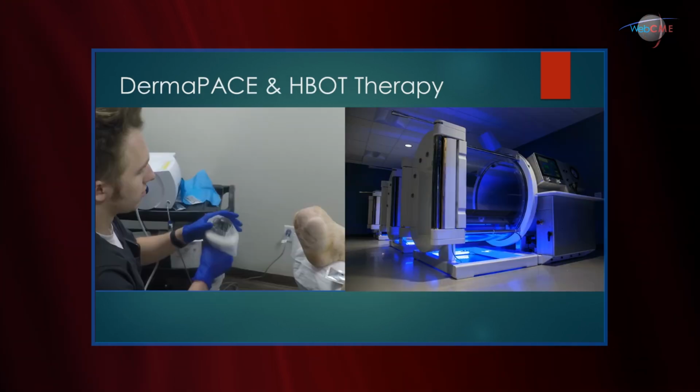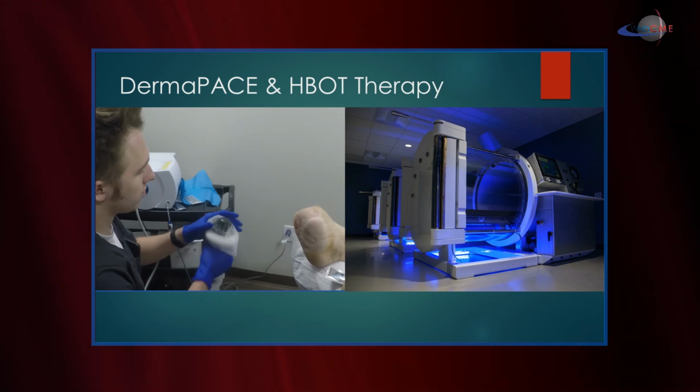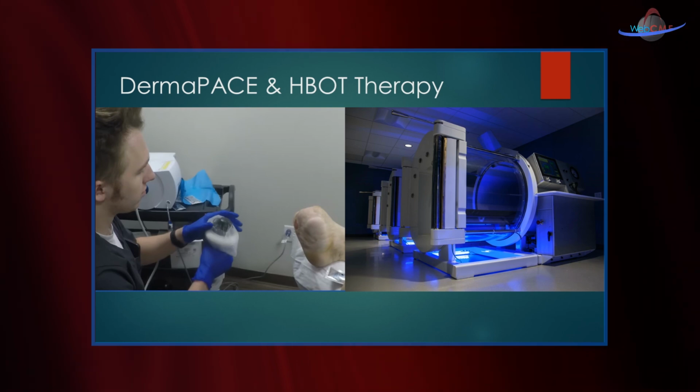We also decided that we would do some DermaPACE and some hyperbaric therapy for this patient based on his compromised diabetic foot ulcer and surgical incision that was compromised. We have a full service here in our wound care clinic, and we have just wonderful hyperbaric technicians and hyperbaric chambers to complement our patient care. And we're also utilizing DermaPACE.